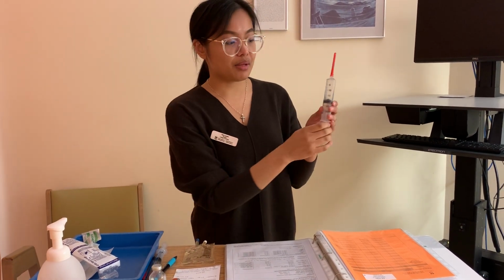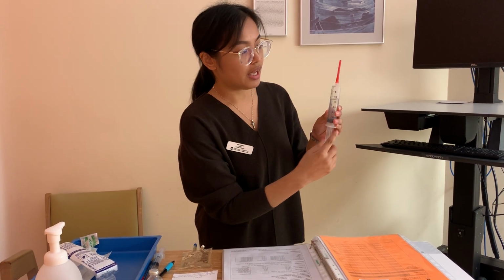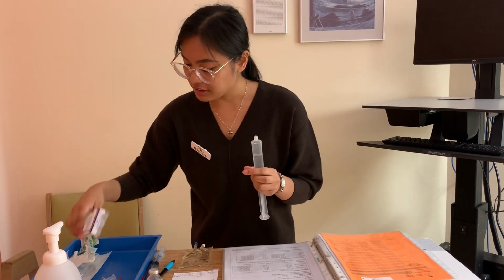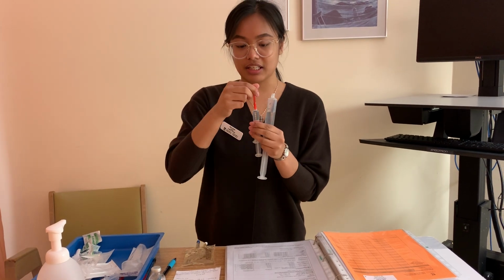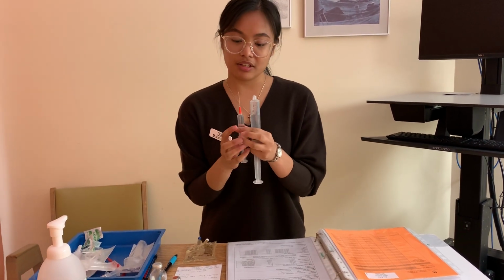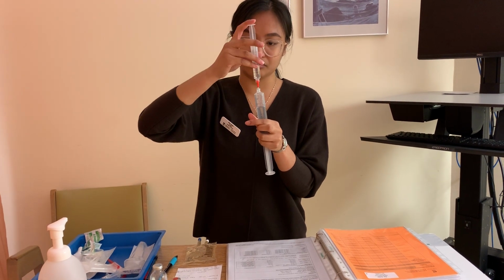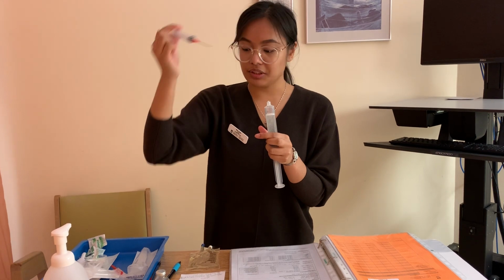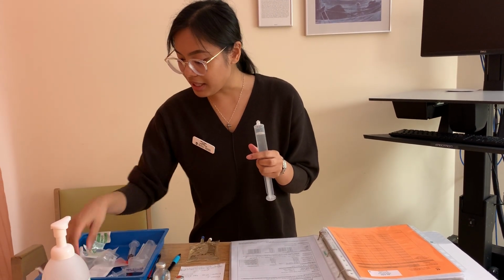Now that I know I have my 20 mLs, I'm going to put the plunger down so I have enough room to install my other medication. I'm going to put this in the sharps container, and I'm going to grab my syringe, maintaining sterile technique, then cap. This goes in the sharps container, and I'm going to install my medication. Okay, and this would go in the sharps. I wouldn't recap it. And now since it's a CIVA, I'm going to get a blue cap.